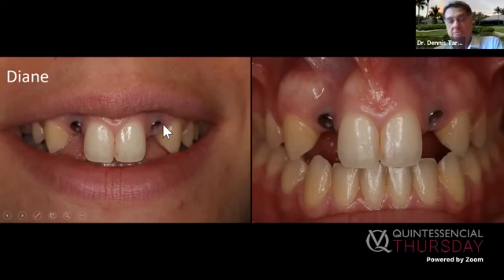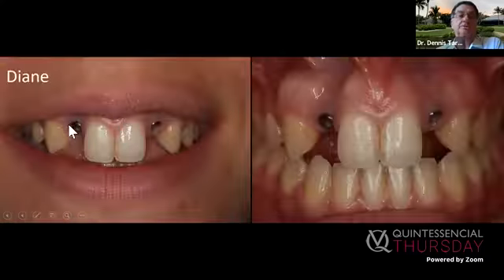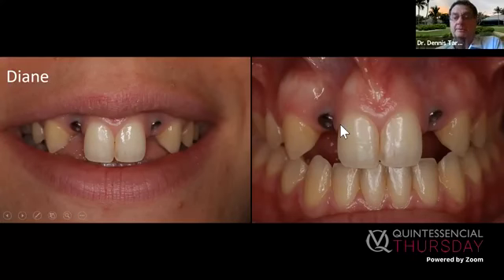Do you take them out? Well, it certainly was a thought, but she's deficient in tissue and bone. You can see them here. You see the deficiency. I think it's pretty clear. The one good thing is she has what? She has papilla. And I don't want to touch those. Now, I know a lot of people, and we can talk about this, would open up probably cuspid to cuspid minimum, do big grafting, beautiful grafting.